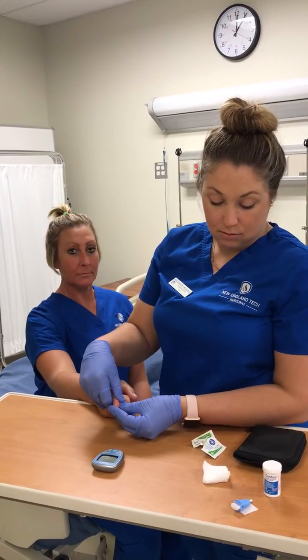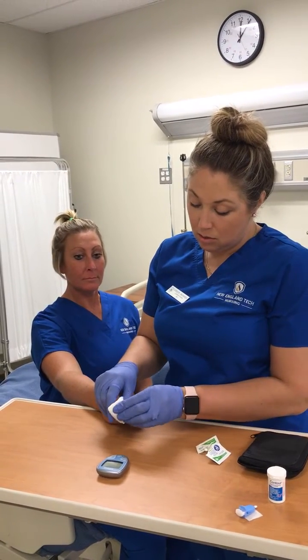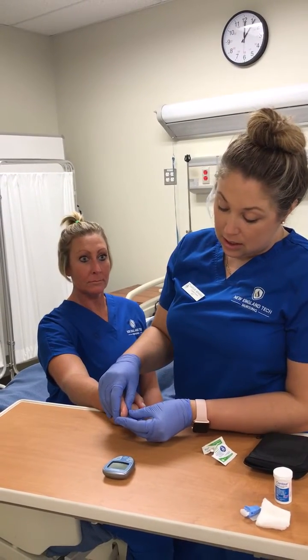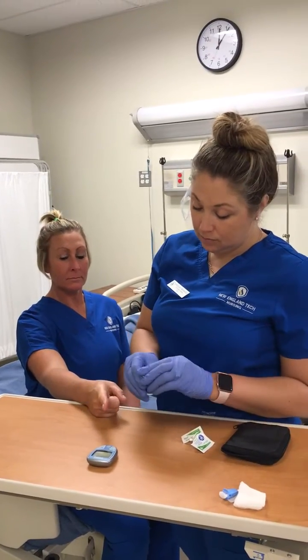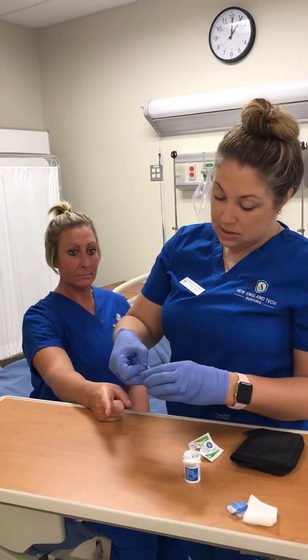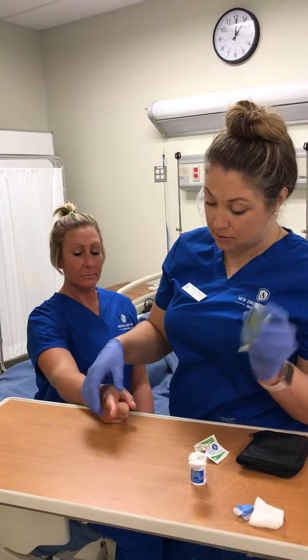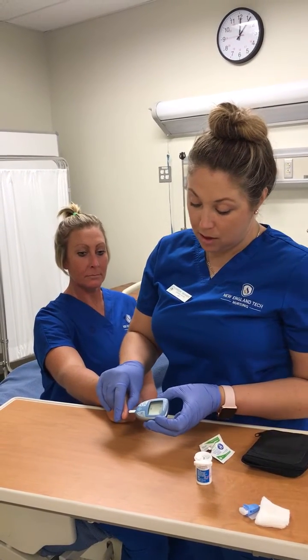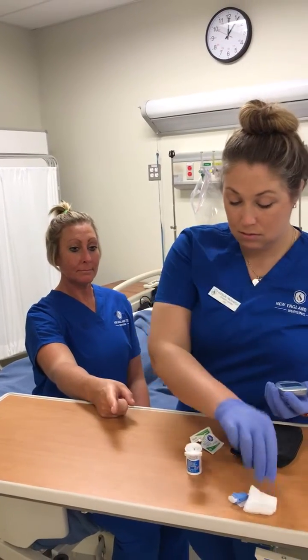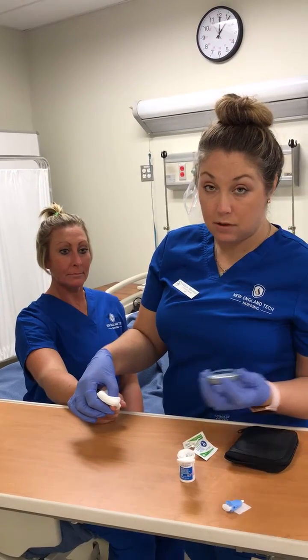You would then milk the finger to get some blood and wipe the finger with a 2x2. Then with the second drop of blood, you would take the test strip, insert it into the meter. It's blinking that it's ready. With the second drop of blood, you would touch the test strip to it, put some pressure on there, and then wait for the meter to read.